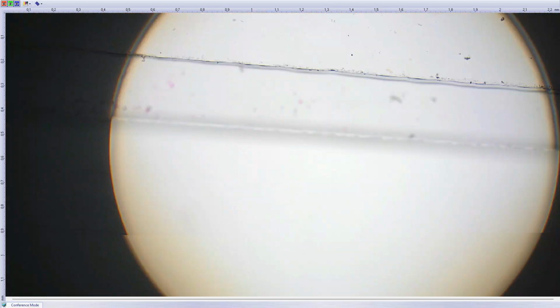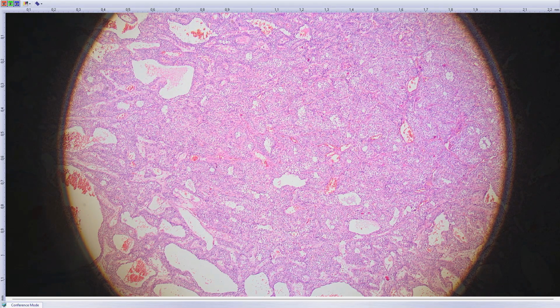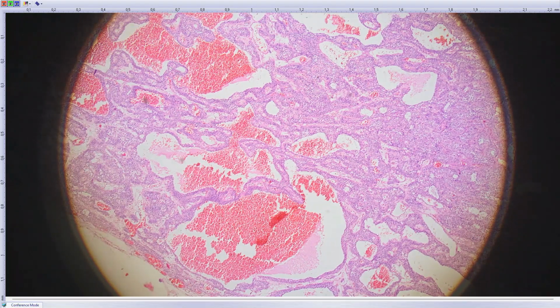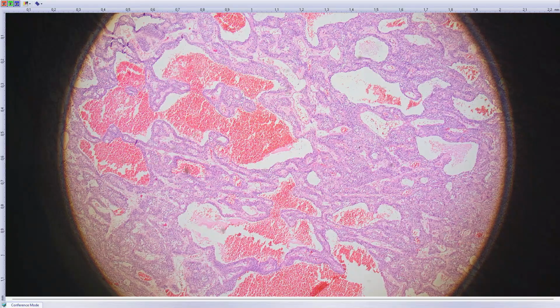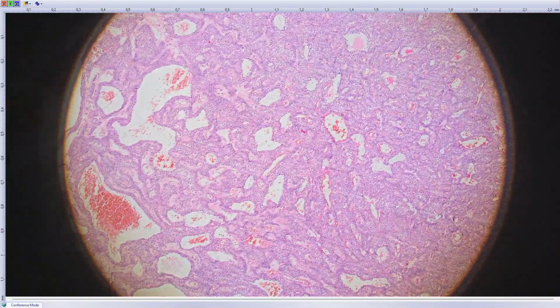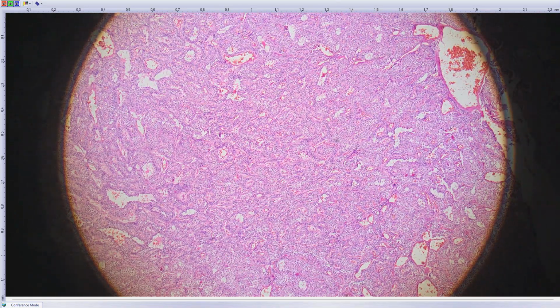And my second case is a biopsy from a 34-year-old male, and it's a lesion, intradural L1 to L4 lesion. So it's a central nervous system biopsy. And in this low magnification, you can see something which looks a little bit organoid, adenoid, or angiomatoid pattern, trabecular pattern, and a little bit solid.